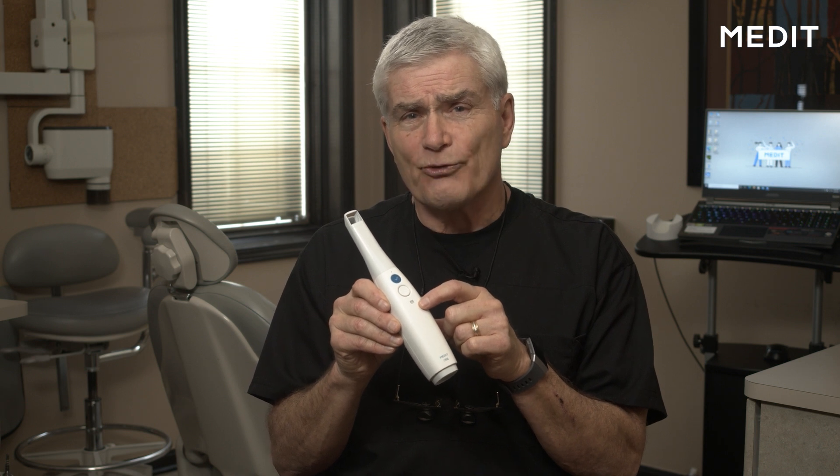And then it's got this little button down here that actually lights up when it's disinfecting itself on the inside. It's the only scanner of its type that has a self-disinfecting UVC light on the inside. This thing is incredible. Not only does the new i700 have an incredible scanner interface — the actual hardware itself, the component — but the software is intuitive as well.